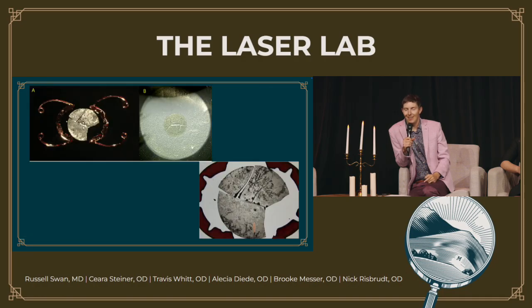Okay, this one. I remember being in the pathology lab in Utah when this lens got sent in, and my nerdy professor, who was maybe Professor Plum, was just unusually excited to see this. This is actually a glass IOL that was yagged. So back in the 1980s, there was a company that actually made IOLs that were made of glass. And they had this PMMA haptic design, and then the optic would sit into it.